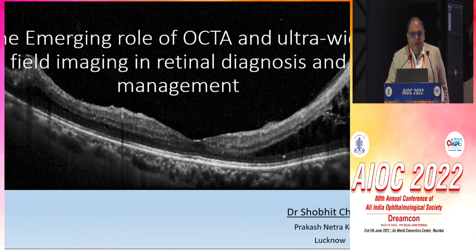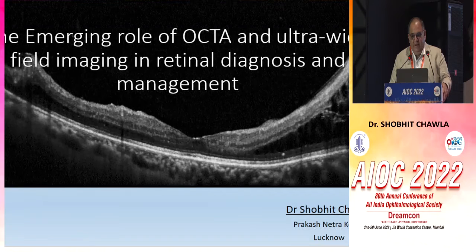So a good imaging system is what helps me see more, make a diagnosis, follow up my patients, make a treatment strategy, and monitor that medical or surgical treatment. And that is what ultra-wide field imaging and OCTA have provided.